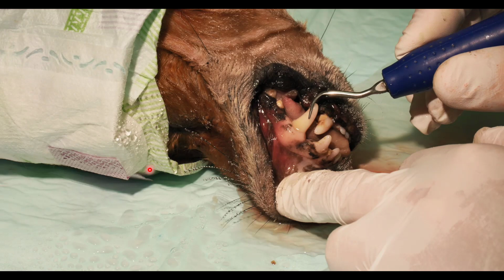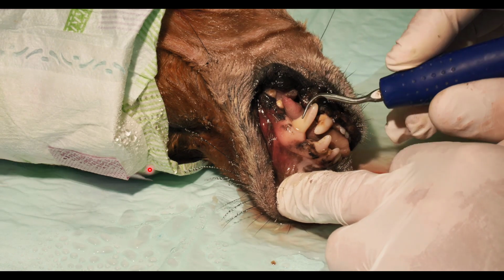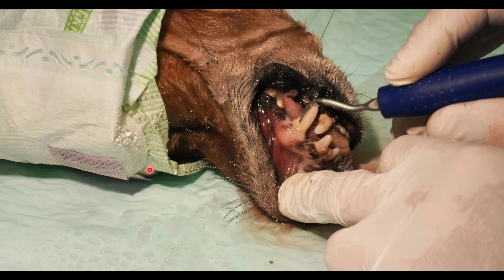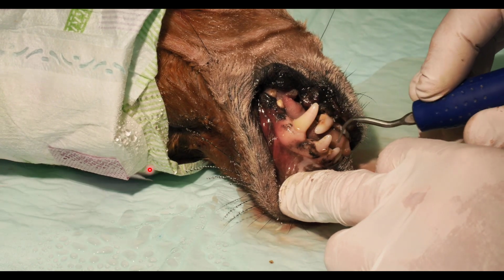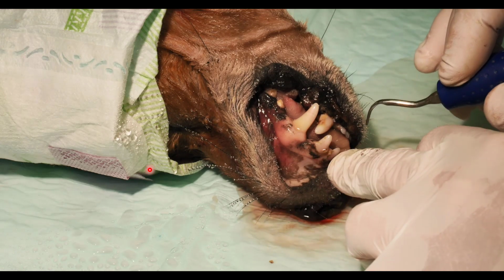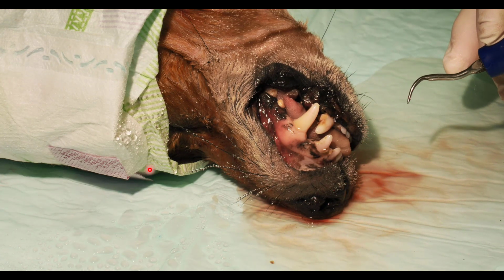That is why it's critical, number one, to have good coolant spray, and number two, make sure if you're inducing this underneath the gum, that you have a subgingival or universal tip so you don't overheat the tooth underneath here. And so all you're going to do is clean the entire surface of all these teeth and do the inside and then roll them over and clean the other side. And then you're done with your ultrasonic scaling.